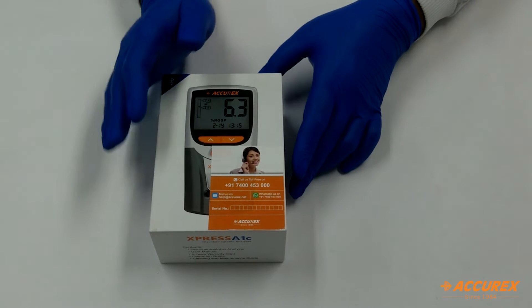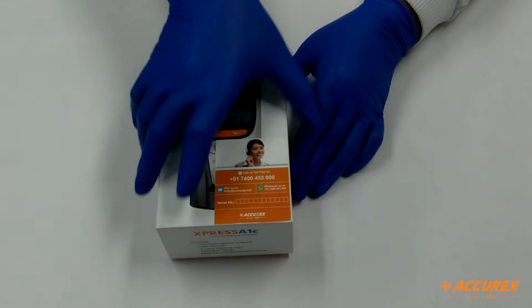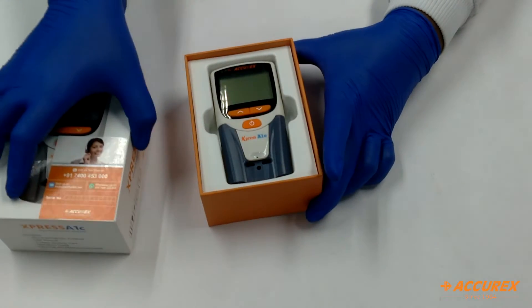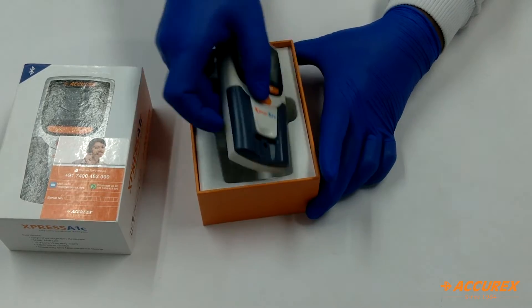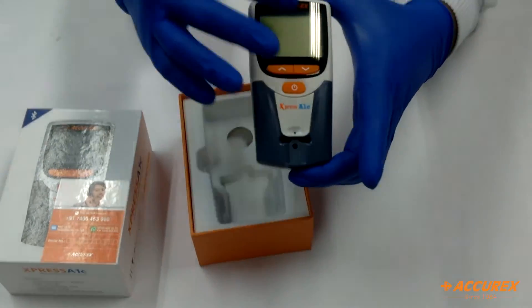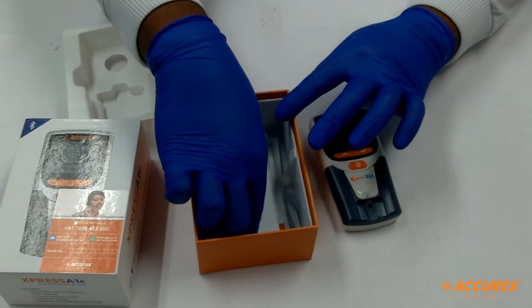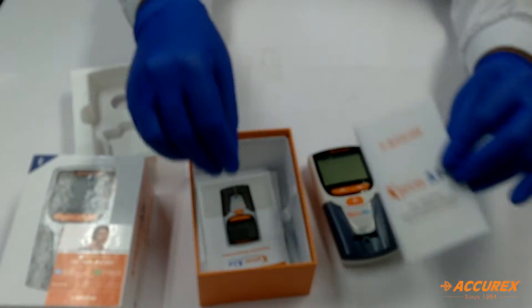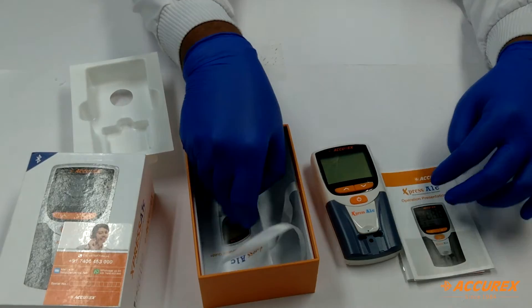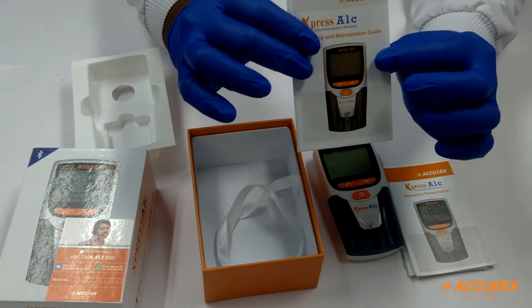We will see what are the components inside this Express A1C analyzer kit. First you can open the box. You can see the meter — this is the Express A1C analyzer device. Then we have the A1C manual, the operational manual, and the cleaning and maintenance procedure guide for the customer.